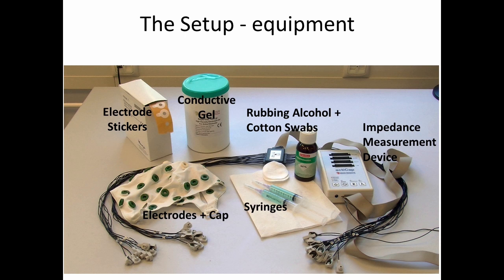EEG involves recording electrical potentials from the scalp, and as a result there's a number of different pieces of special equipment that we need. On the left you see EEG electrodes and the cap that we'll use to put those electrodes on the person's head. In order to get a good signal from the scalp we need to use a conductive gel — essentially a jelly that has a lot of salt in it — that is placed inside syringes, and we use those syringes to fill each of those electrodes and make sure that they have good contact with the scalp.